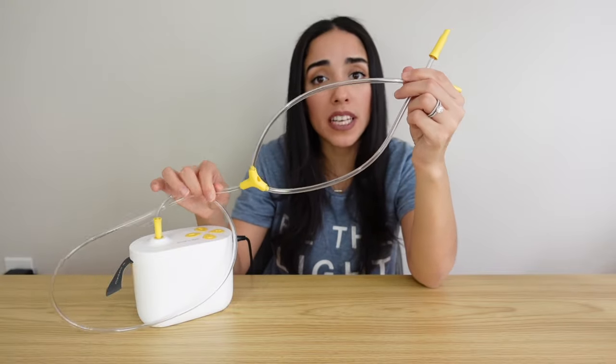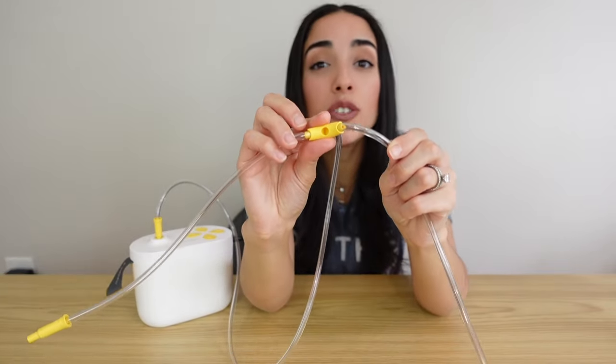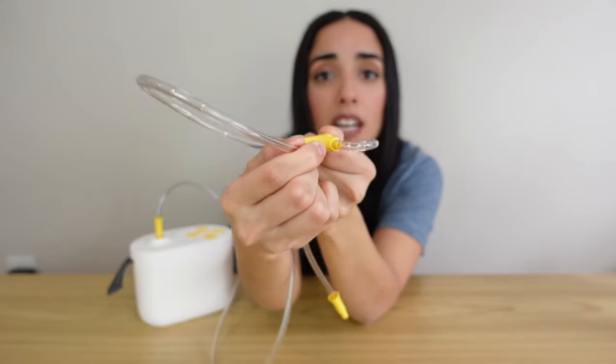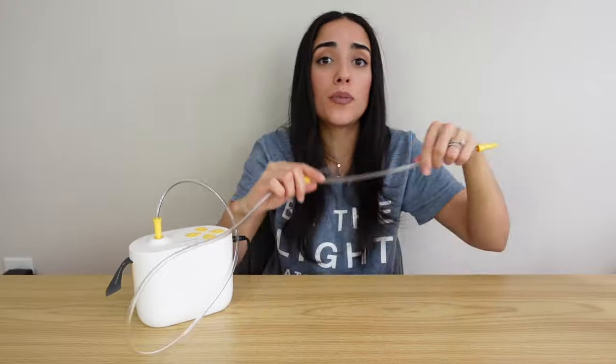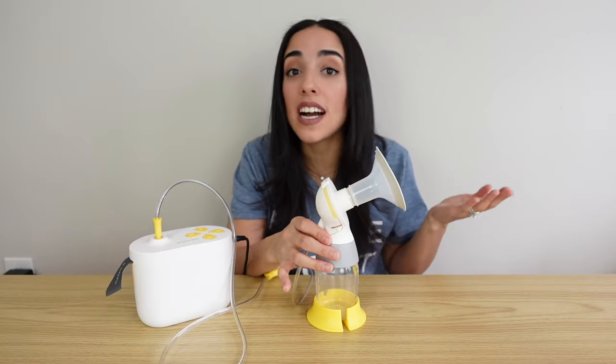This pump also has two features I really love. On the tubing pieces there's a hole that allows you to use this pump as a single electric pump. Instead of plugging both pieces in, you plug one piece into that circle to seal off that tube, and then you have a single electric pump — really nice for moms who want to pump on one breast while breastfeeding on the other. I also love the little strap on the pump; when transitioning from one room to another, it lets me hold the pump without worrying about the motor accidentally falling.